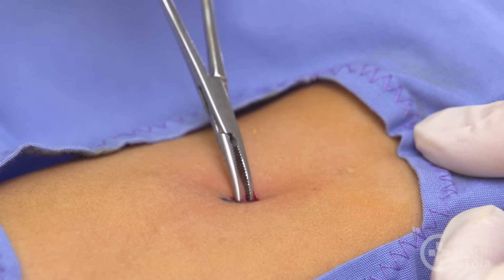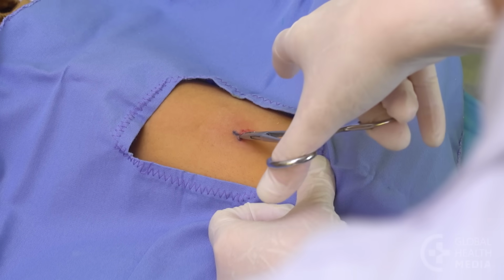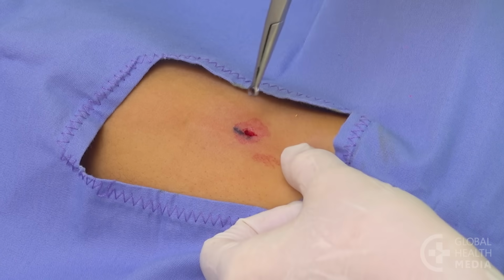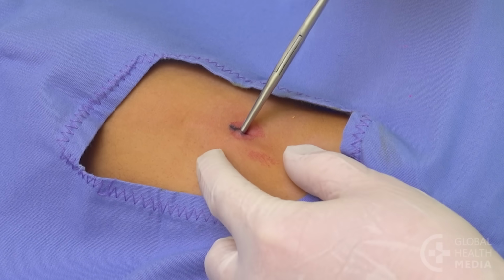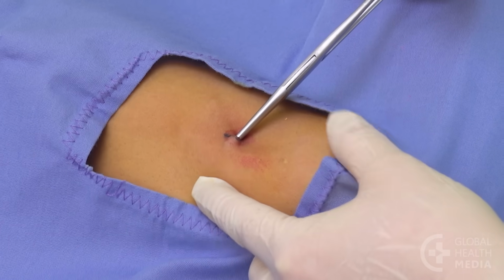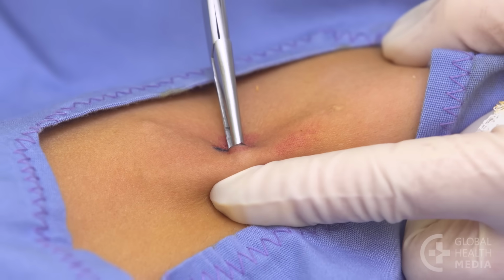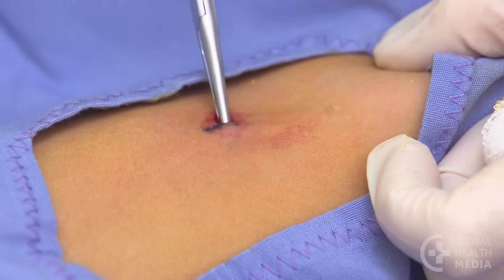Bluntly dissect the tissue by opening and closing curved forceps to the depth of the rods. Gently push the vasectomy forceps through the incision in the direction of the first rod. Guide the rod and vasectomy forceps together. Open the forceps and grasp the rod. Then slowly pull it towards the incision.